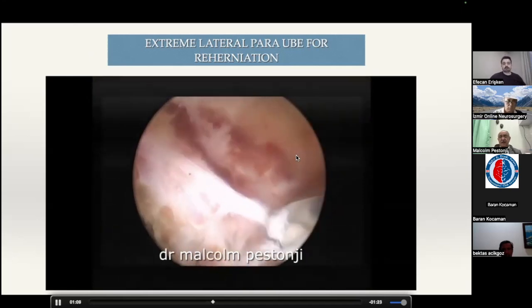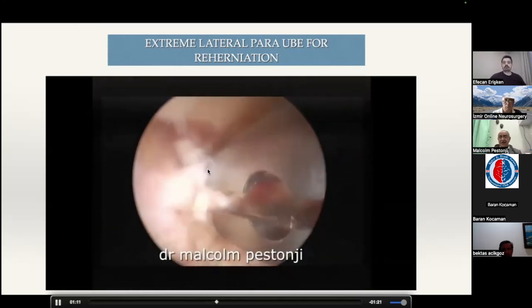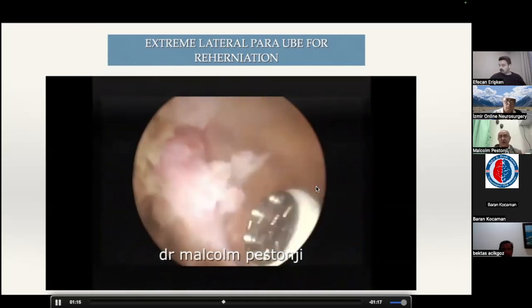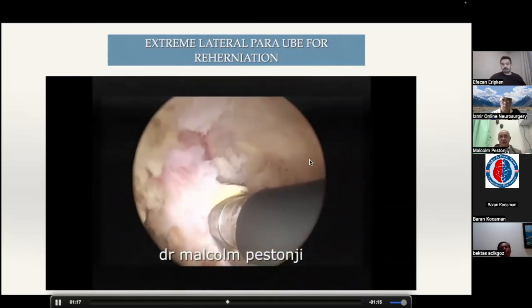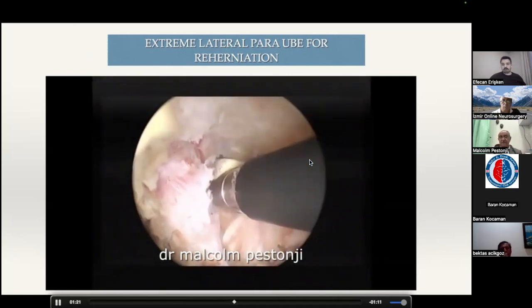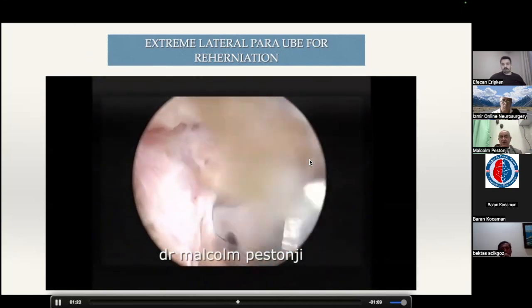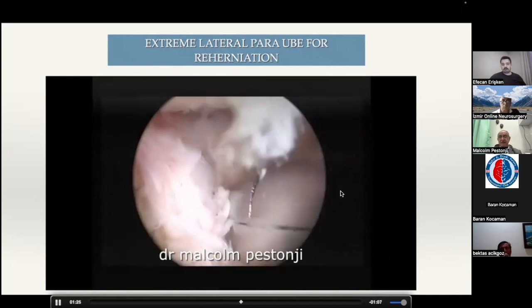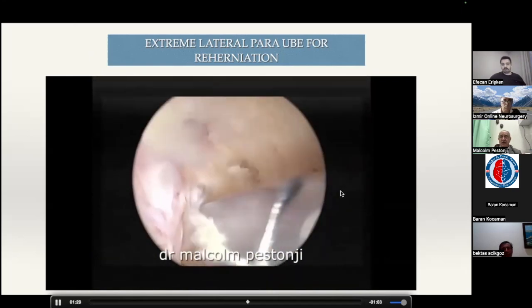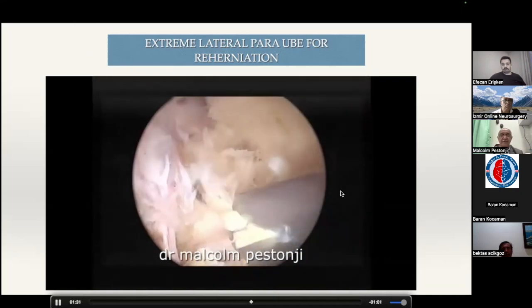And I want to get into the disc. The axilla is on this side. That was cranial to the root. Now we have to come caudal to the root. So on the root itself, you can see I'm using my plasma, and I'm burning away all this tissue, then putting in my disc punch, finishing the remnant of the discectomy that I needed to do, or maybe the surgeon had left behind.